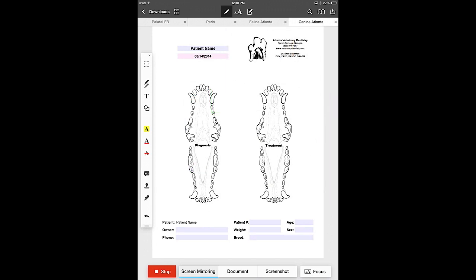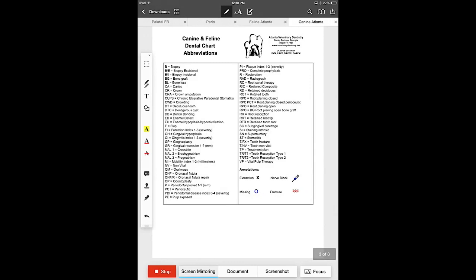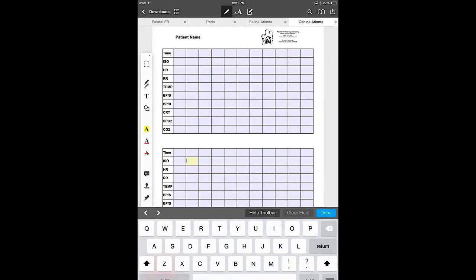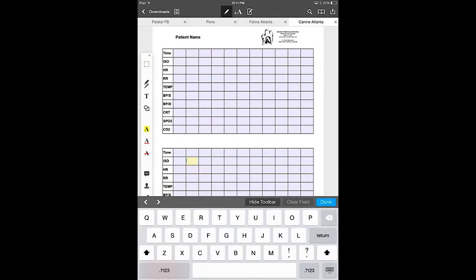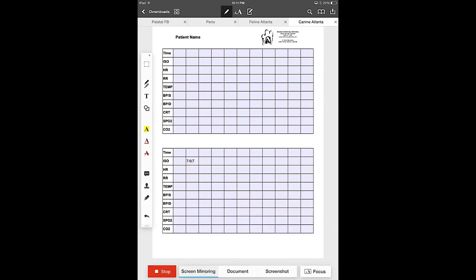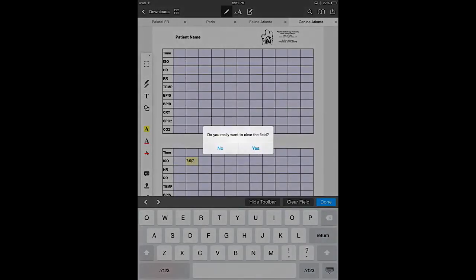Each of these charts consists of eight pages. This is the first page which is the diagnosis and treatment skull. The second page has room to put history, physical exam, clinical and radiographic comments, treatment and recommendations and comments. It also has the arcade cartoon there that you can use to annotate and record pathology as well. The third page is a list of the dental charting abbreviations. The fourth page is an anesthesia record. There's also an additional space for the annotation of the anesthesia record in case you have a situation where you have a longer anesthesia.